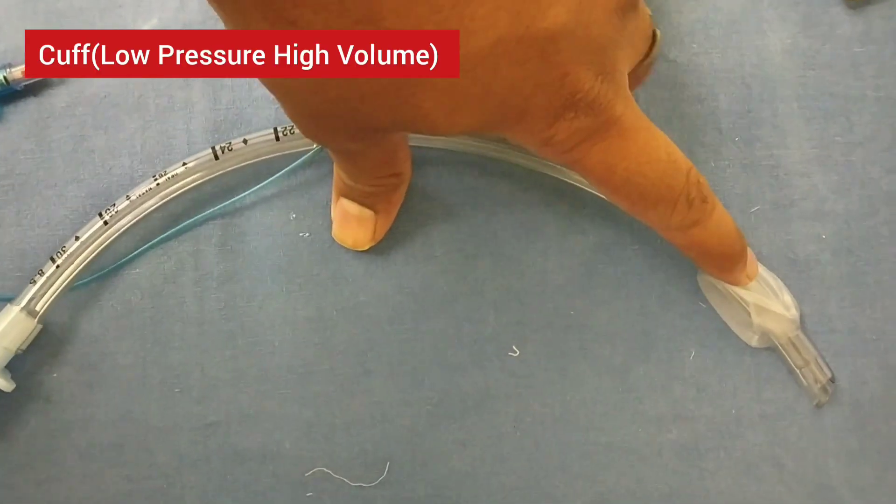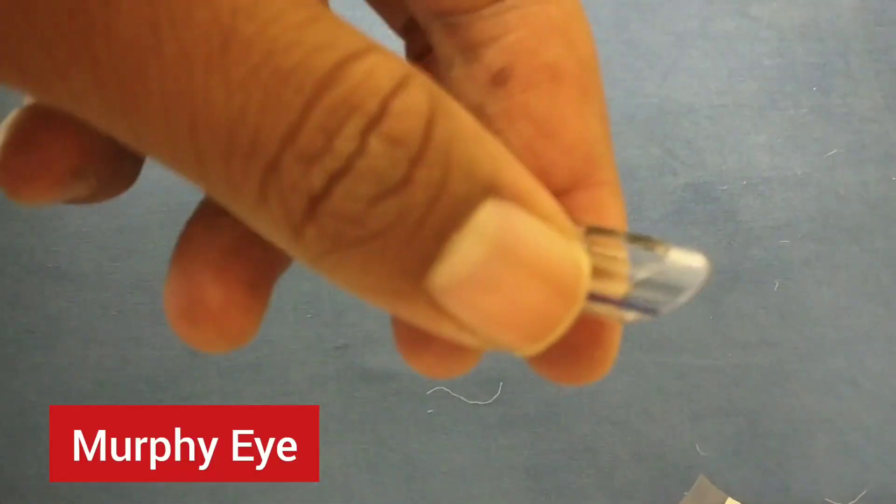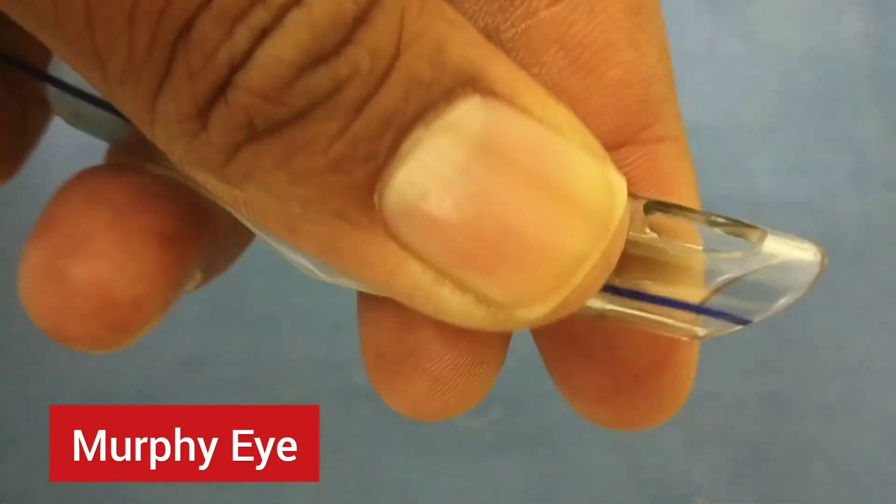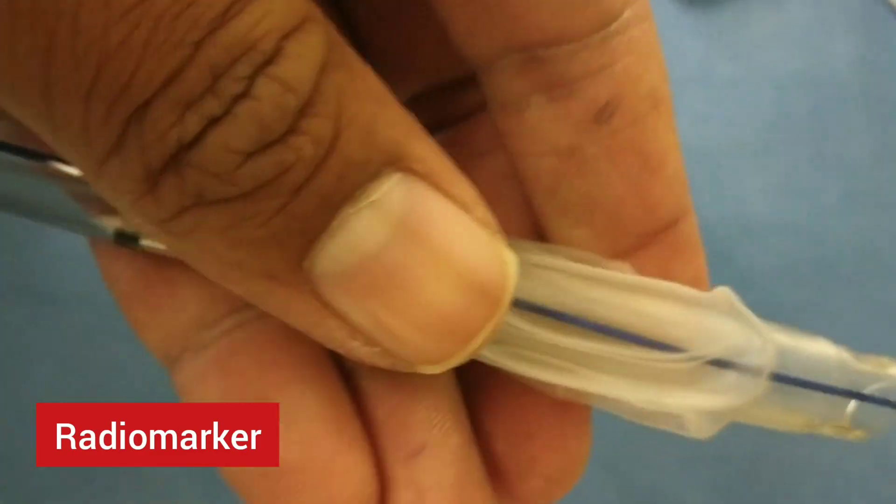After that we can see the cuff, then there is a bevel, and we can see the Murphy's eye. The blue line that we can see is a radio marker which helps in visualization of the ET tube in x-ray films.